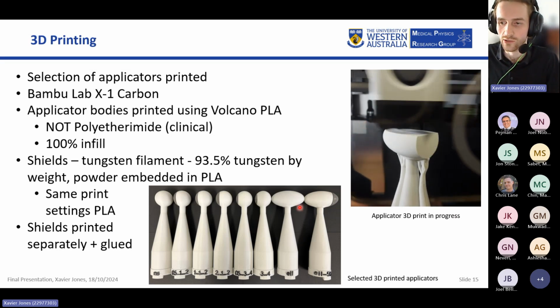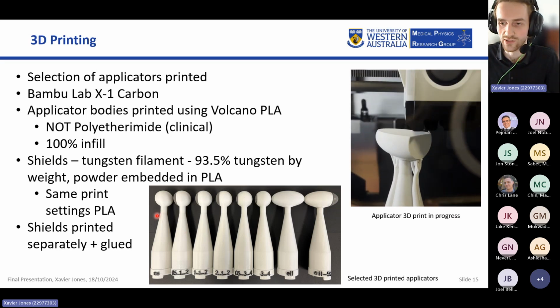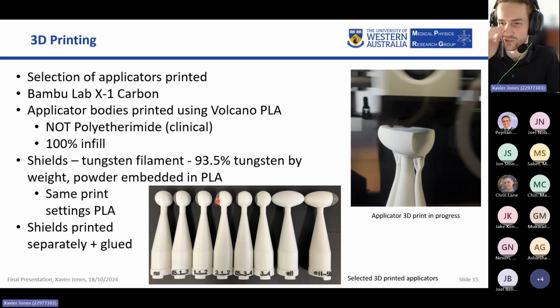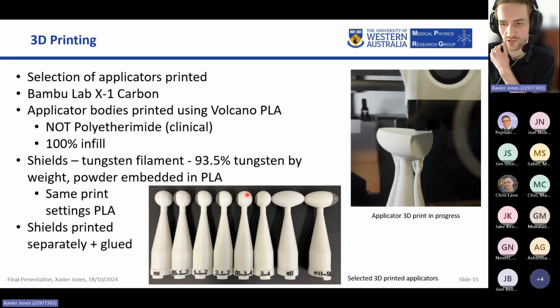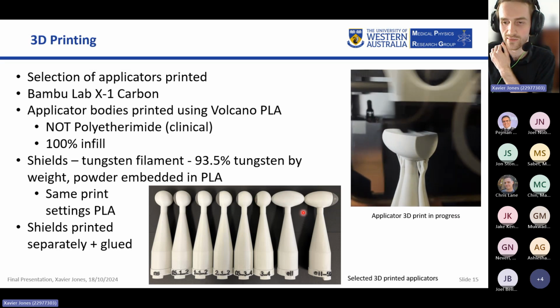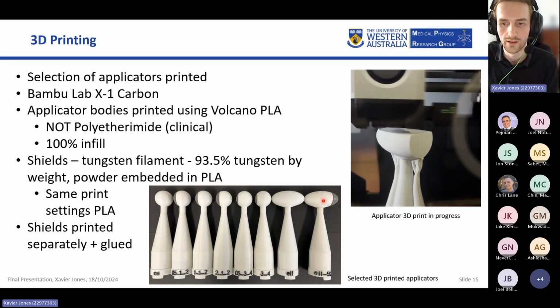This image depicts all applicators 3D printed for dosimetric measurements. They include a regular unshielded applicator, 3 embedded shielded applicators with shield position 1/2 with thickness 0.5, 1, and 2 millimeters, 1 embedded shield applicator of position 3/4 and thickness 0.5 millimeters, 1 sliced shield applicator of position 3/4, an ellipsoid unshielded applicator, and a shielded ellipsoid applicator with position 50%.